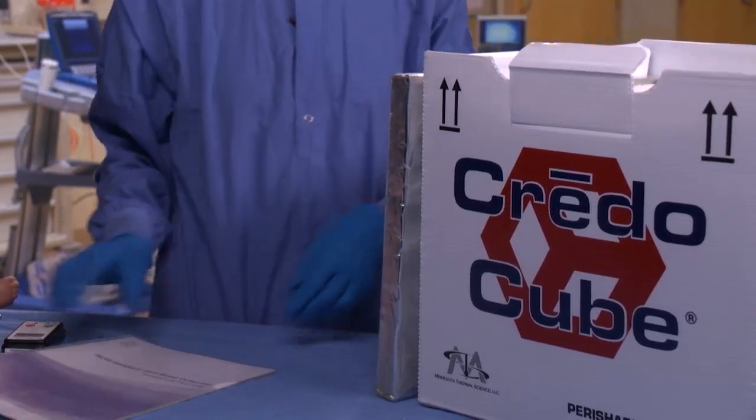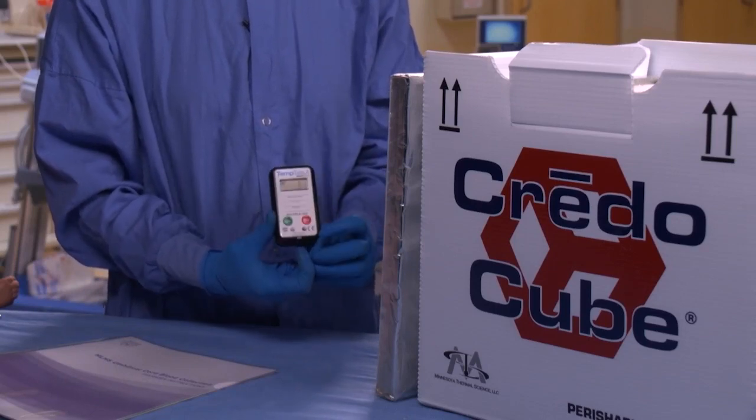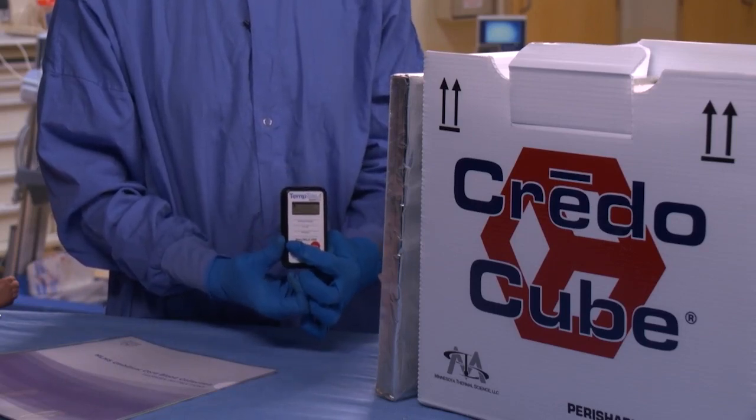Also included in the kit is a temp tail, which records the temperature during shipping. Activate the temp tail according to the provider instructions.